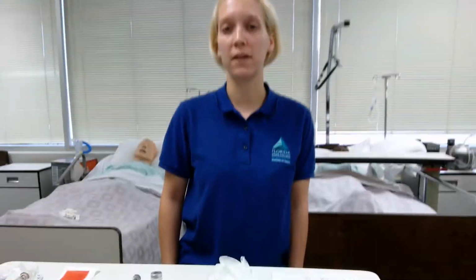My name is Alexandra Blacka. I'm going to be performing a secondary piggyback IV med today. I usually have my badge on. I apologize, I misplaced it.